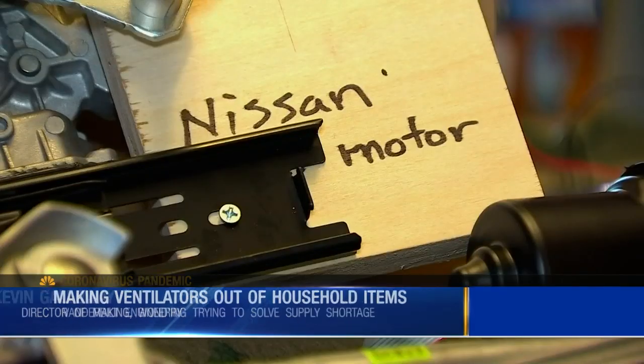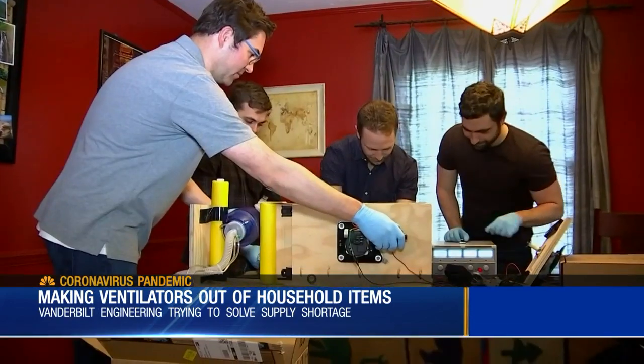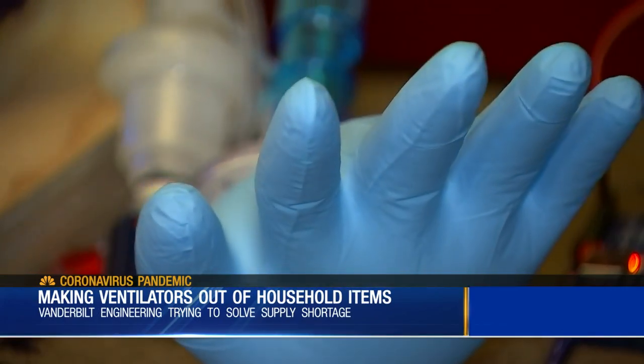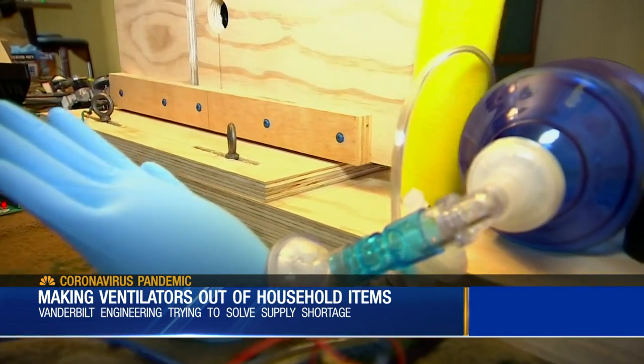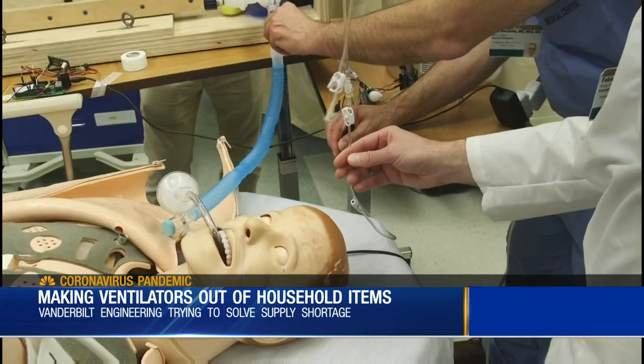Trying to think of what do I have available in my garage, things that people would have access to — a table saw, drawer glides, and thinking what else would somebody have access to, something like a windshield wiper motor. Engineers at Vanderbilt have only been working on this since Saturday, but this is the third prototype. With this current design, this one gives the doctors a lot more control over how much volume of air they're going to push into the patient.